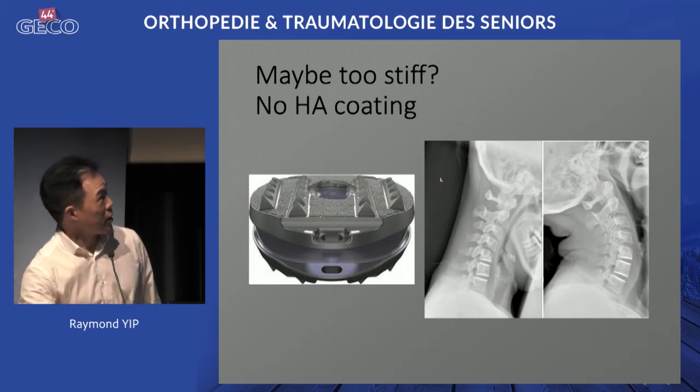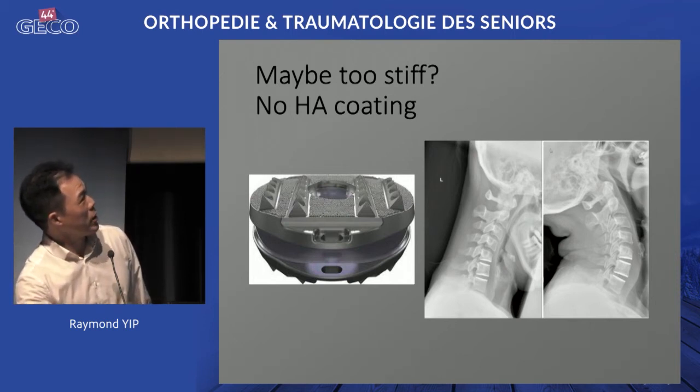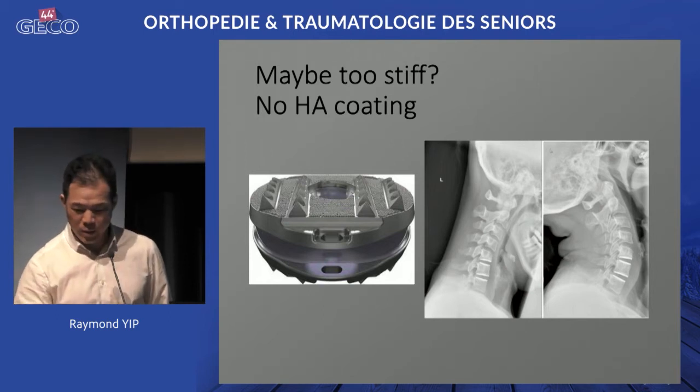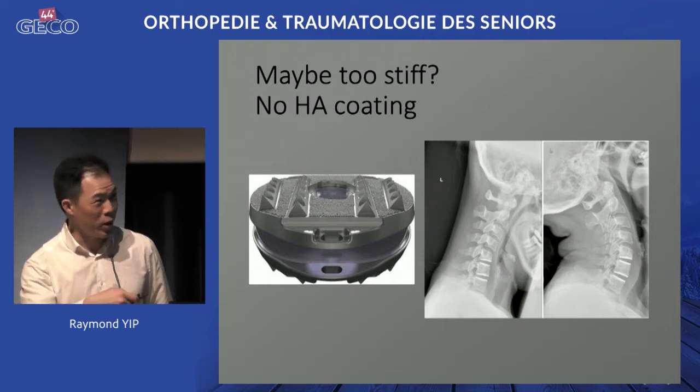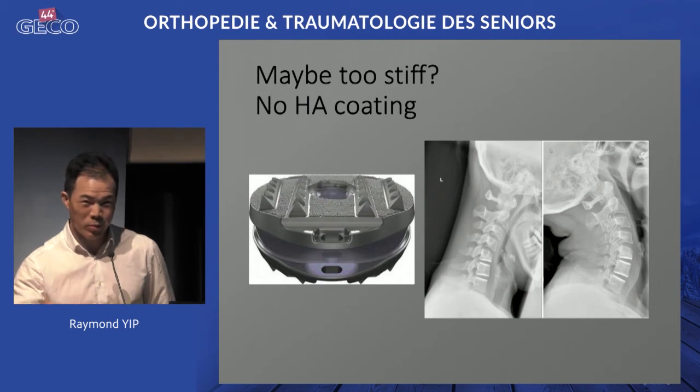This is another viscoelastic implant, so not all the same. This one may be too stiff. You see there's very little motion after implantation. There is some, but it may be too stiff. It may be that if the implant is too stiff, there's a lot more force concentrated on the end plate, so the end plate bonding may not be as good as the mechanical type prosthesis, which is probably too loose. So we don't actually see any problems with the mechanical interface between the bone and the implant within the mechanical type prosthesis. It's a less common problem. This may be acting more like a fusion cage, so there may be problems trying to get the fusion of the end plate to the bone.